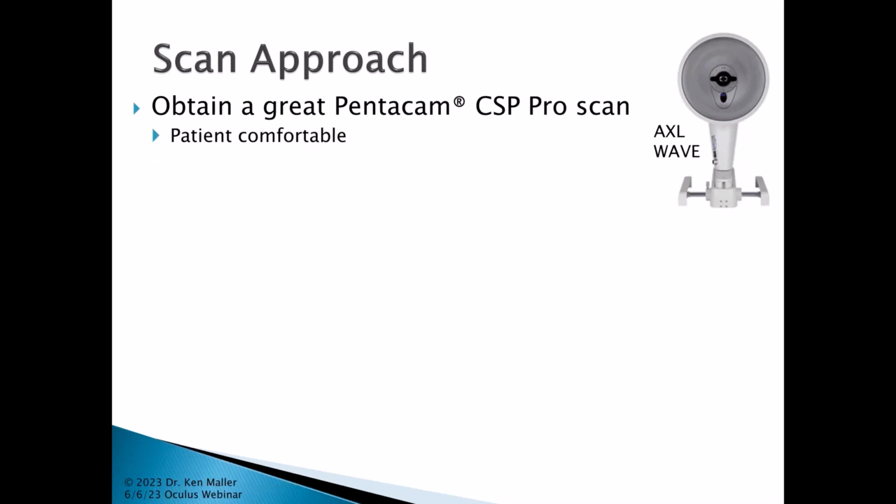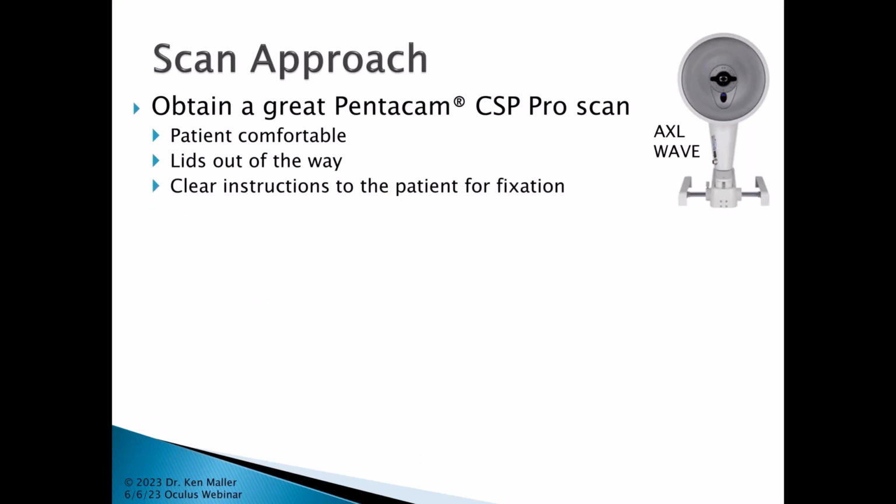You have to get the patient comfortable because they may be sitting there for a little while. You definitely want to get the lids out of the picture. They are of no help to you in designing up the lens. And definitely give the patient very clear instructions for what they need to fixate on when you're doing the scans. And then get proper training for the operator.